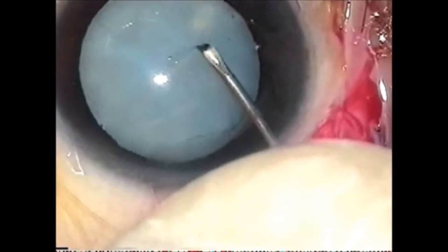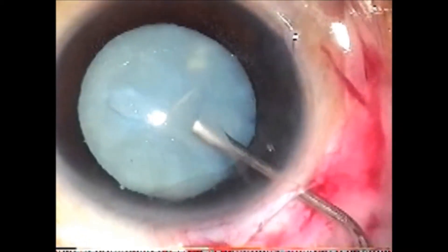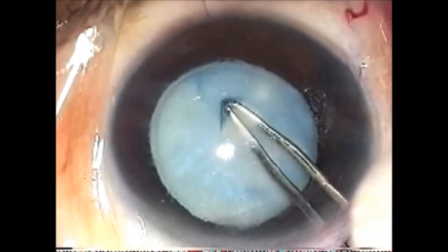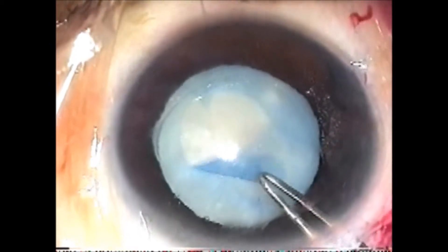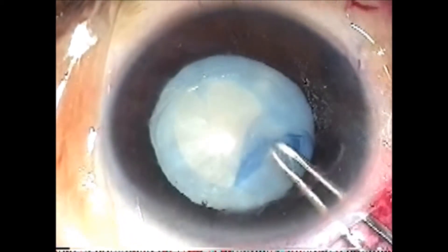This is a case of a mature cataract with increased intralenticular pressure. Liquid cortex is removed with BSS wash and the anterior chamber is filled with high-density viscoelastic. Since the chance of a runaway rhexis is high, a UDRATA capsulorexis forceps is used with constant visco top-up.